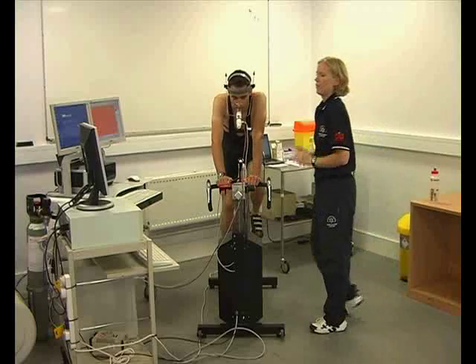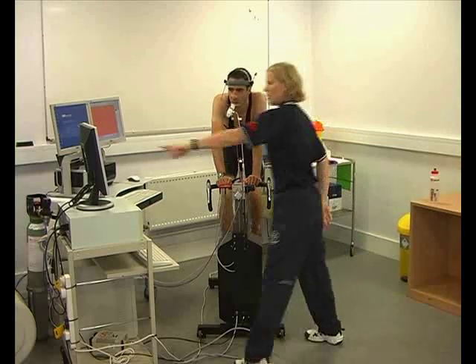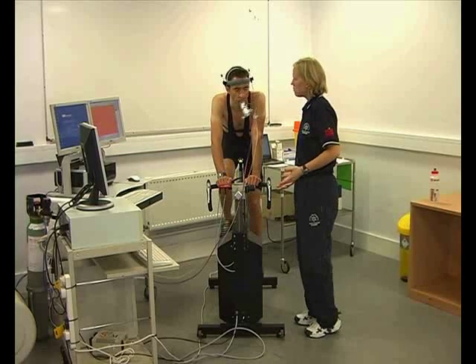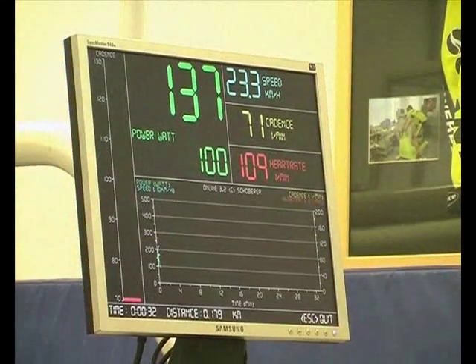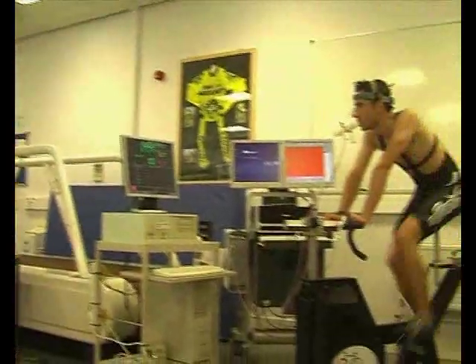At the start of the test, it's just worthwhile pointing out to the athlete what their aims are, just showing them which cadence that they need to stick at. This angle shows us the SRM display a bit more clearly. The top green figure is the actual power, the figure below the target power, and we've also got cadence and heart rate being measured on screen.